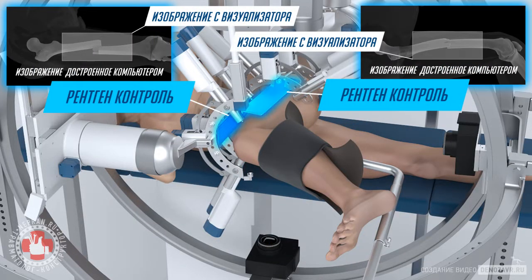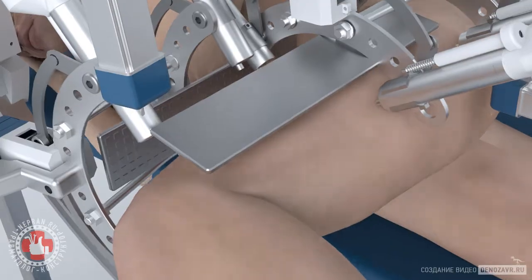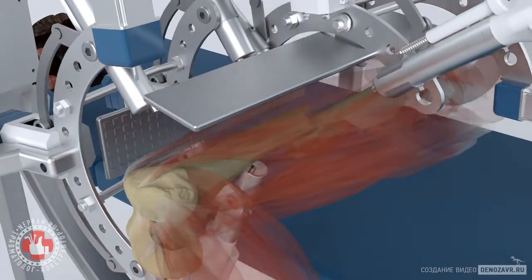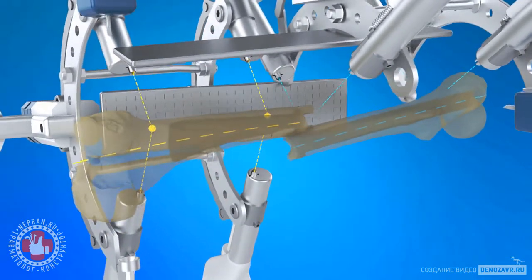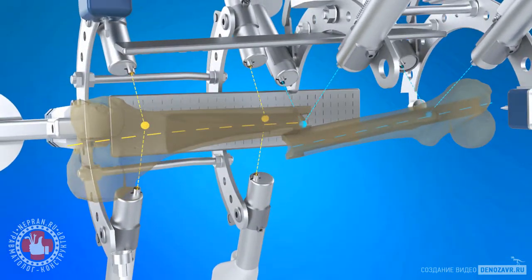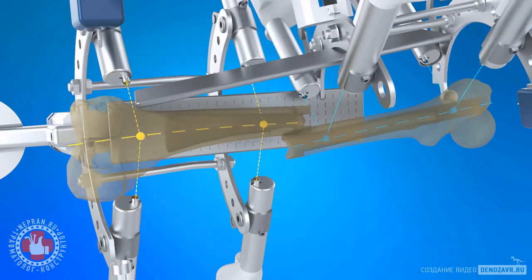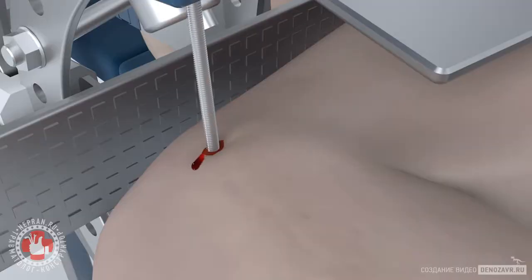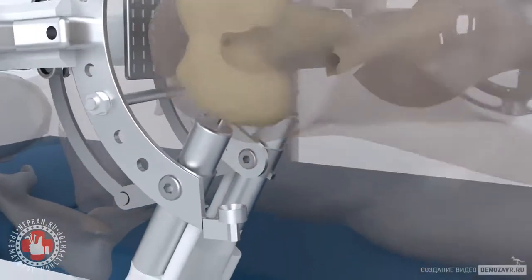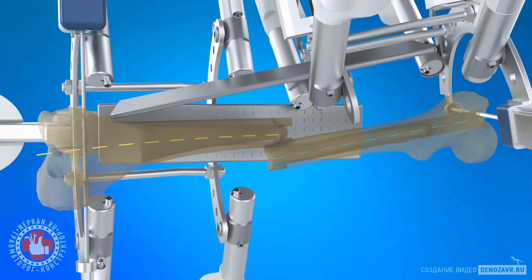The computer aligns the axis of the fragments, and the intersection points of the tool exit axes by the first and second manipulators are set on the axis of each fragment, after which, through the metaphyses of fragments, automatically drawn, fixed, and stretched spokes are threaded, one through each fragment, followed by distraction of the first and second manipulators, until the fragments are disengaged.